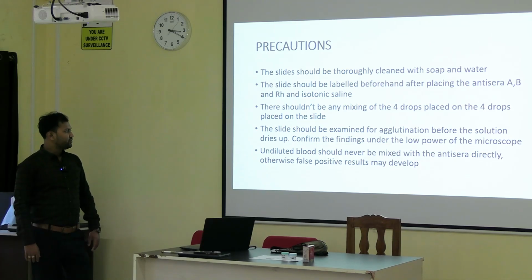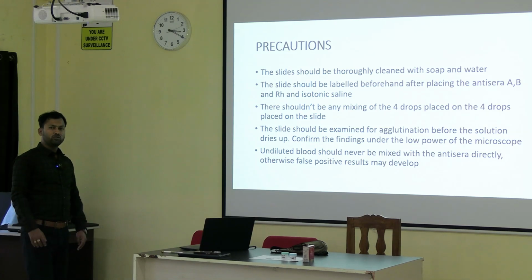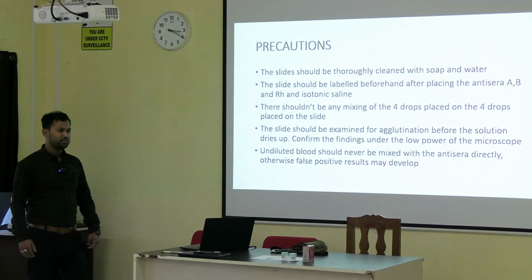Undiluted blood should never be mixed with the anti-sera directly. As I have told you, we have to first dilute the blood by mixing it with normal saline. Otherwise, there will be false positive results.